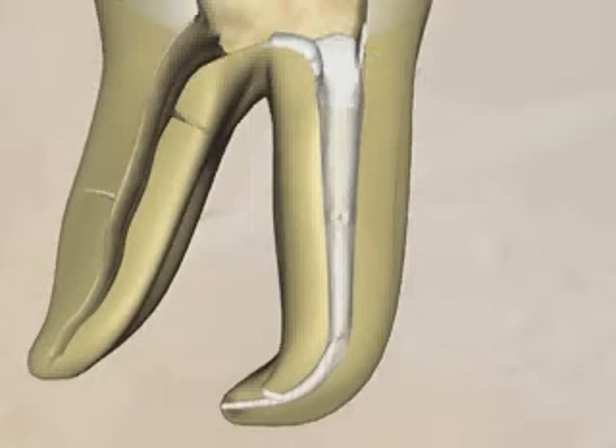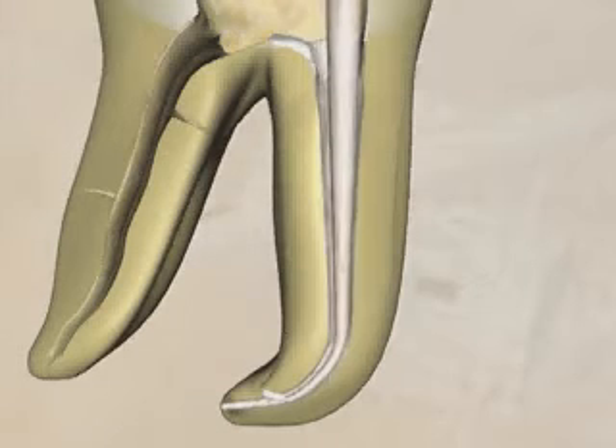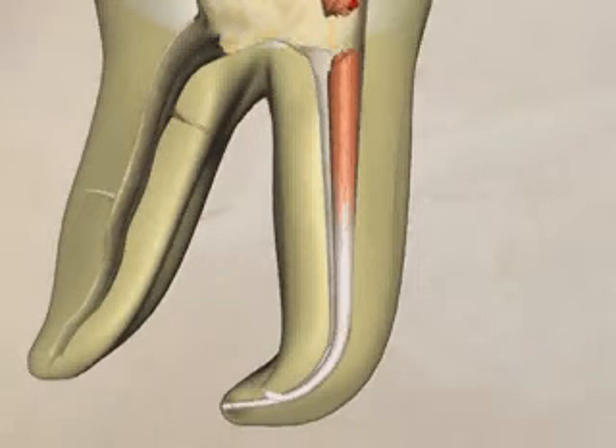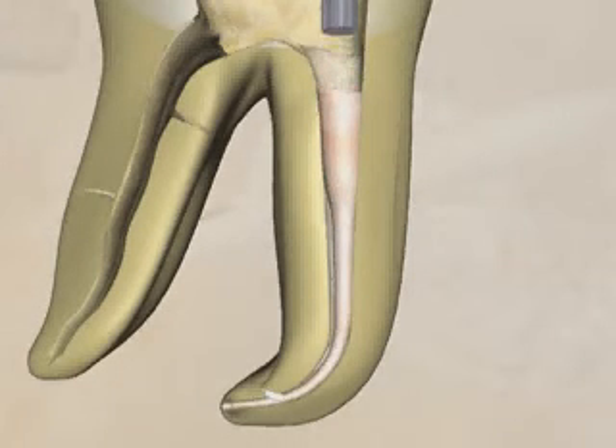The cone is reinserted to length. A heated instrument is used to remove the excess gutta-percha. Downpacking begins with the largest plugger. It is worked around the orifice, then pressed into the gutta-percha mass and held for about 5 seconds and then removed.